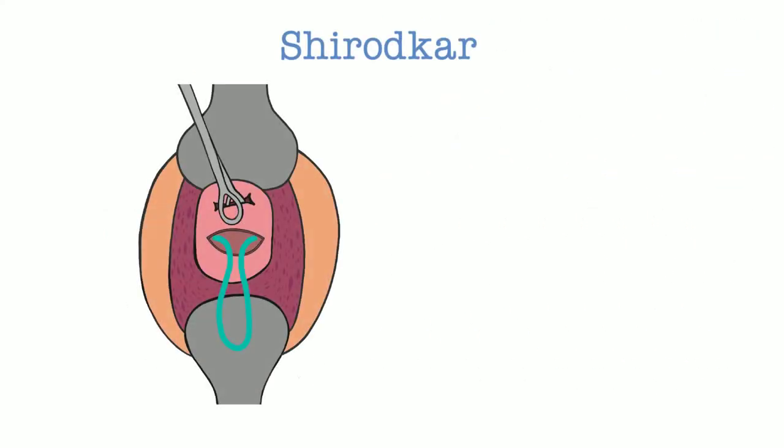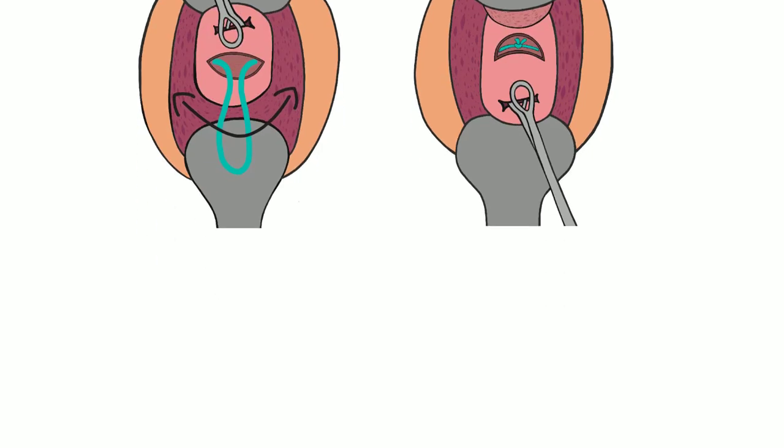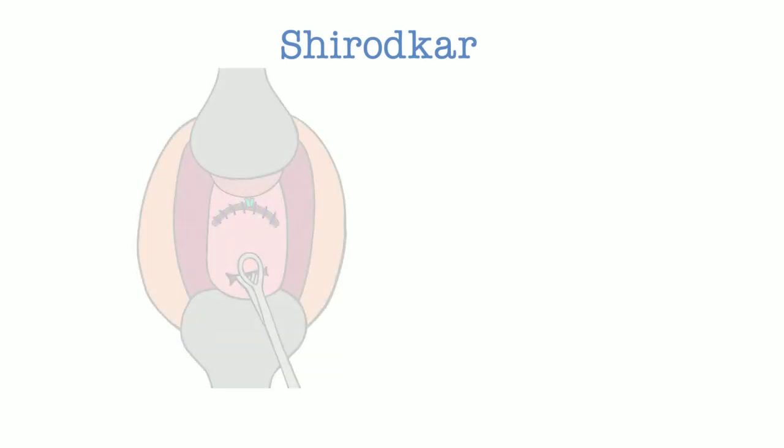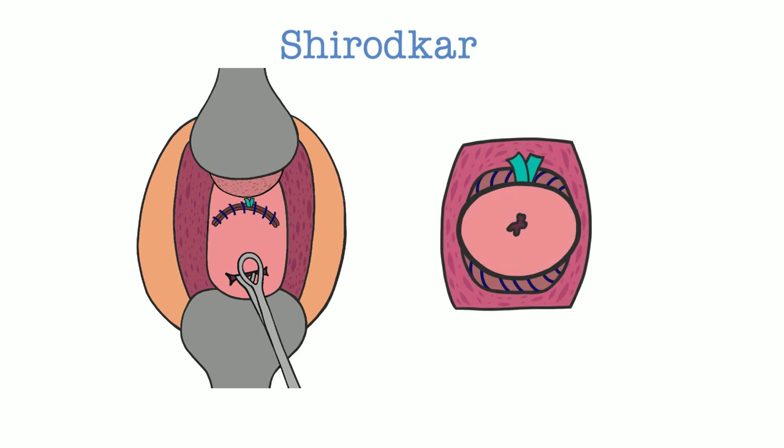After pulling the suture and ensuring it lays flat posteriorly, a knot is thrown and cinched down on the anterior cervix until the internal os will not admit a fingertip. Following cerclage placement, the anterior and posterior incisions can be closed with absorbable suture. Closure is not necessary if there is good hemostasis. If closed, the cerclage tail is left exposed to facilitate removal later in the pregnancy. This completes the Shirodkar cerclage.